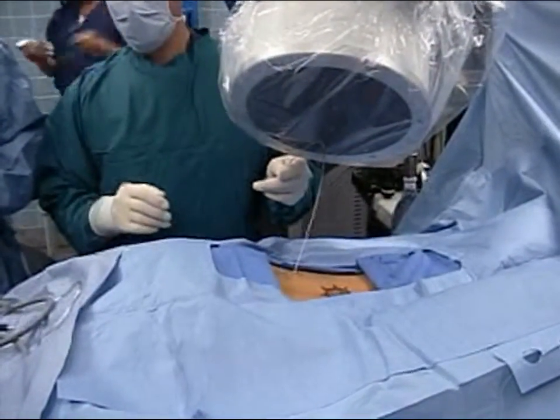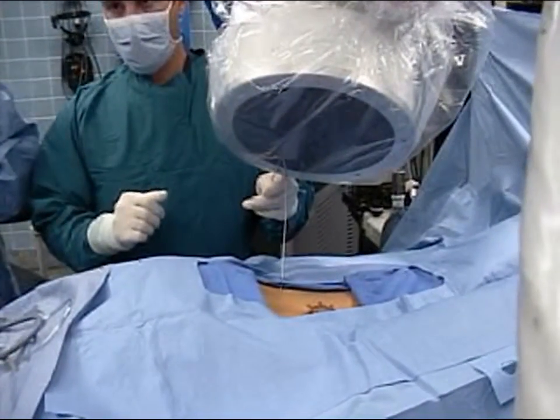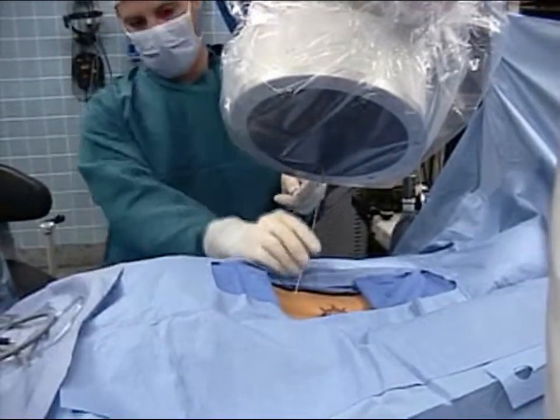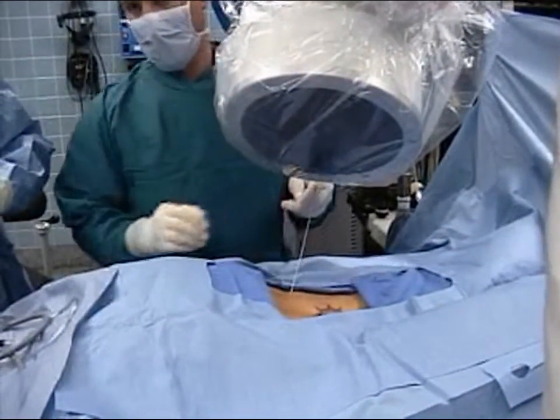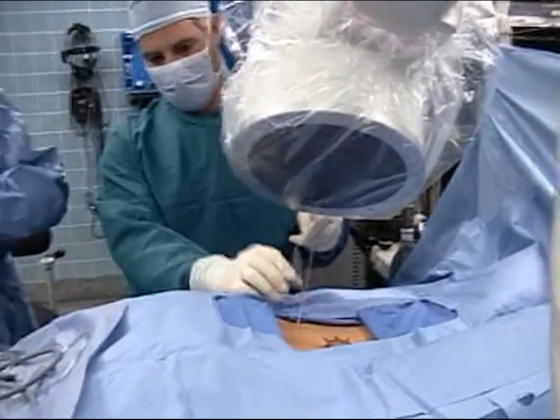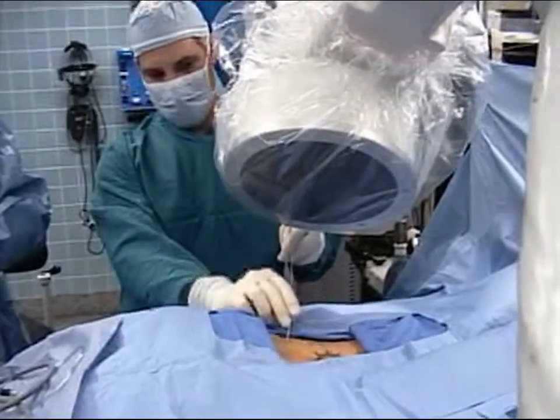Verify your position with AP and/or lateral fluoroscopy. There are many theories about which side of the patient to enter. Some physicians enter the ipsilateral side, others choose the contralateral side, and still others choose either the left or right side based on the layout of their procedure room. All strategies seem to be equally successful.